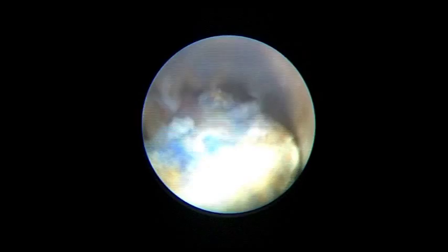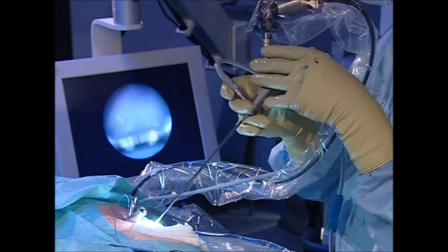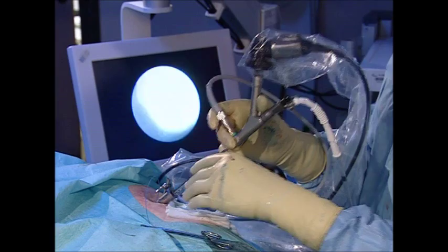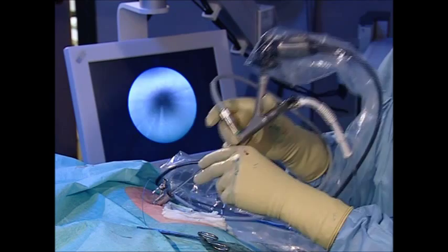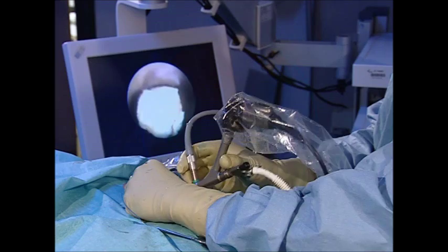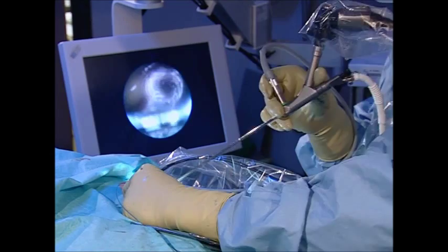Fragments of this size can be retrieved without forceps or Dormia baskets by exploiting the irrigation flow and the resulting vacuum cleaner effect. This effect exists without any increase in intrarenal pressure. It is only necessary to focus on the stone fragment to be retrieved with the nephroscope. The vacuum cleaner effect causes it to remain in front of the nephroscope, which is now slowly retracted. Once the funnel-shaped sheath end is reached, the suction is interrupted by rotating the nephroscope upwards and the stone fragment falls out of the sheath. Stone dust is removed passively at the same time by this effect.